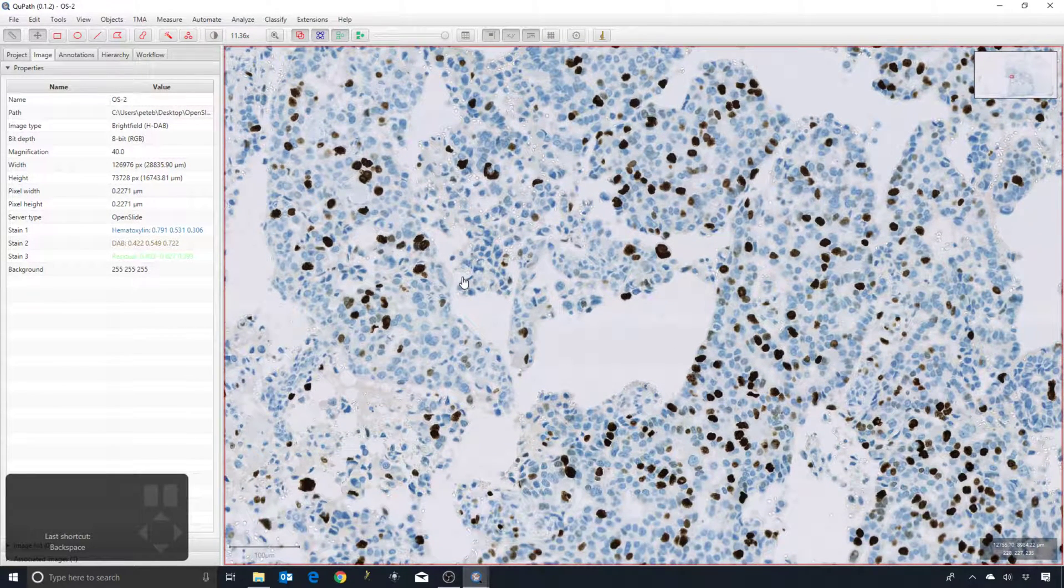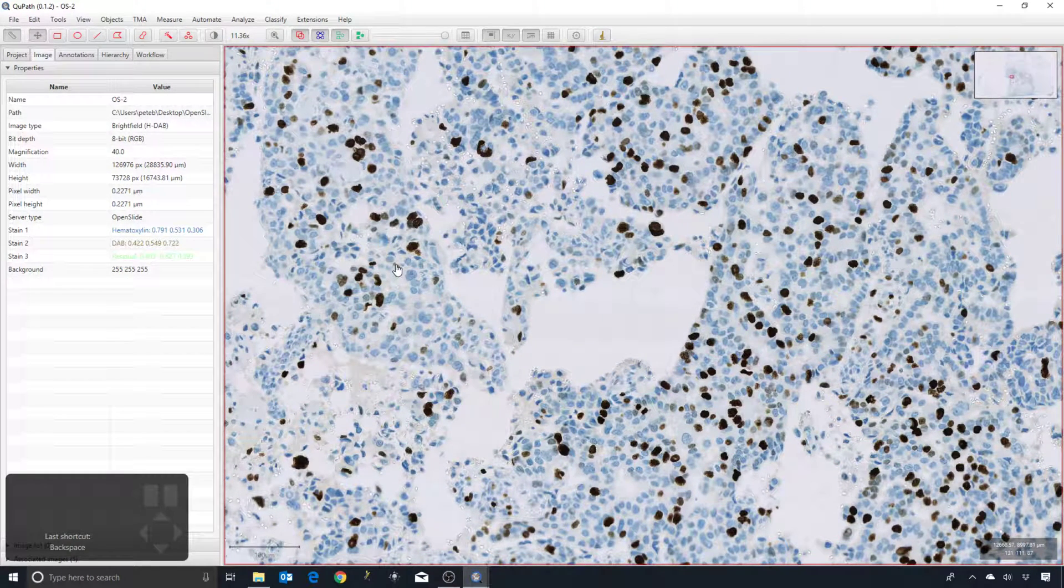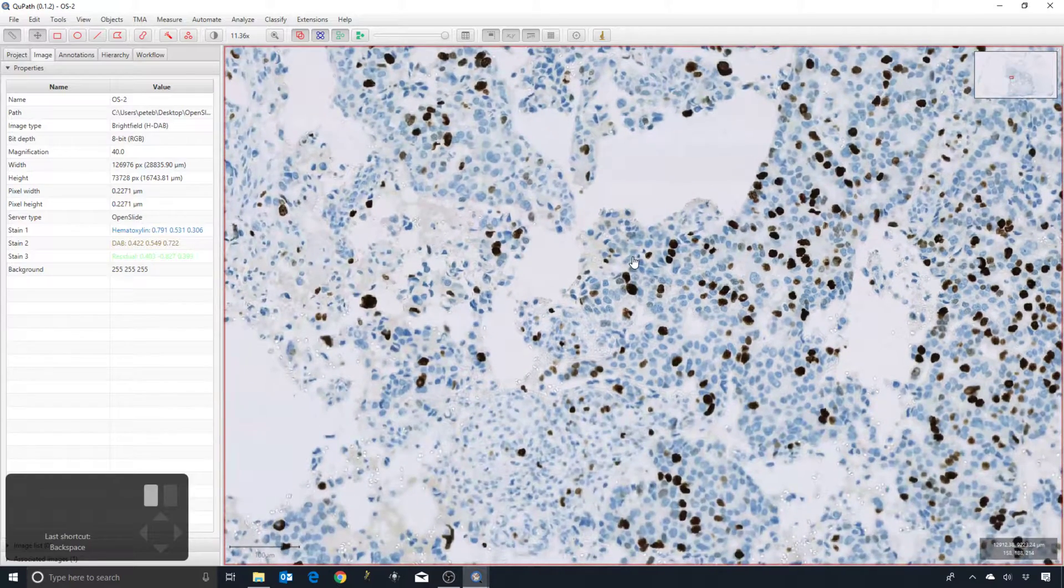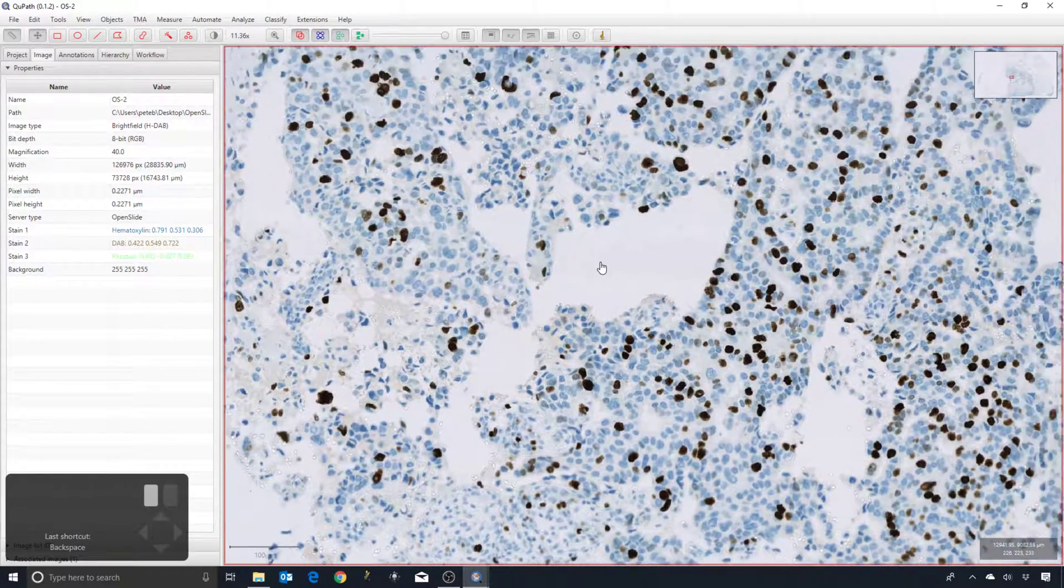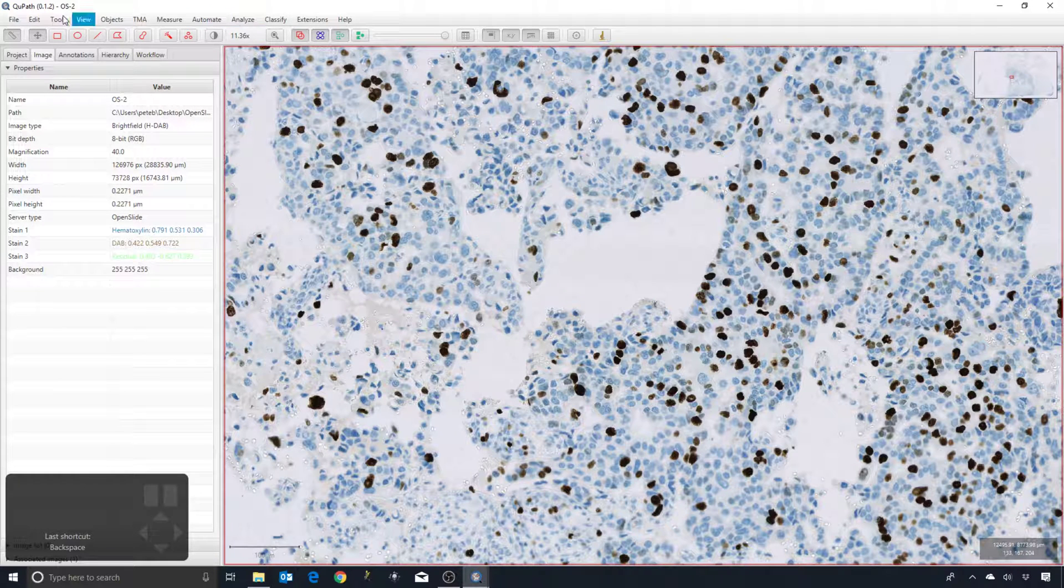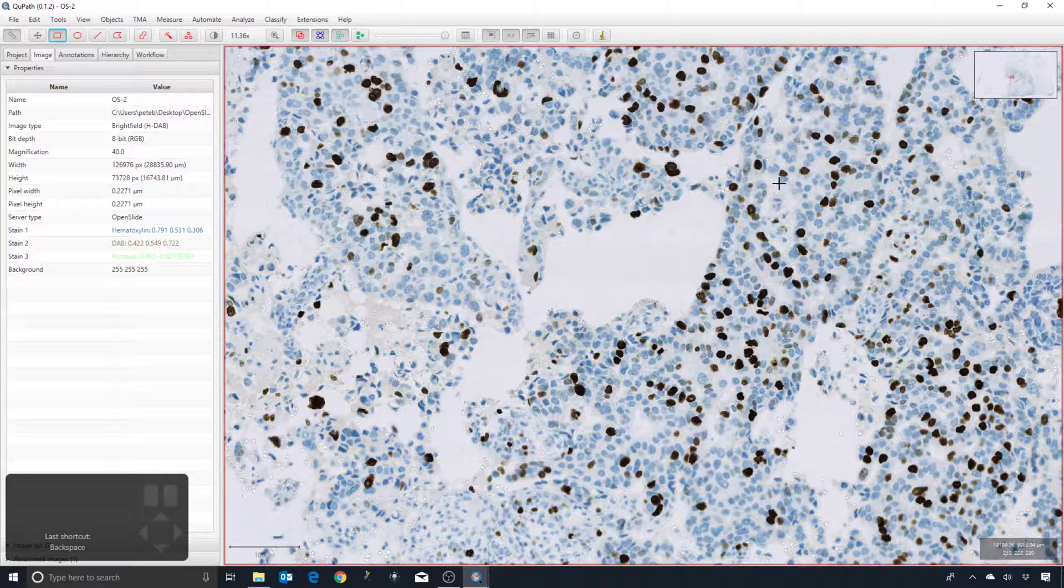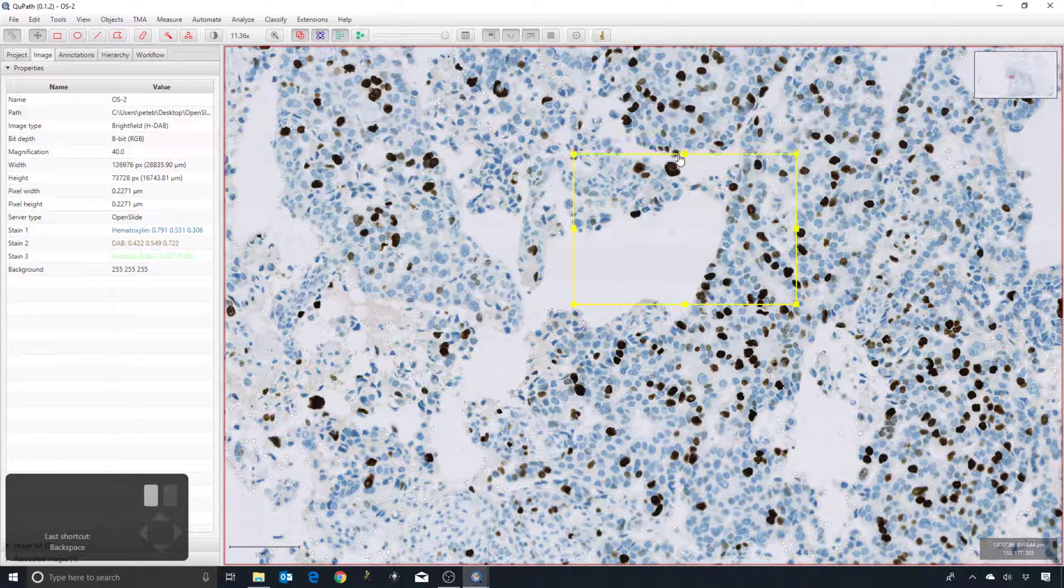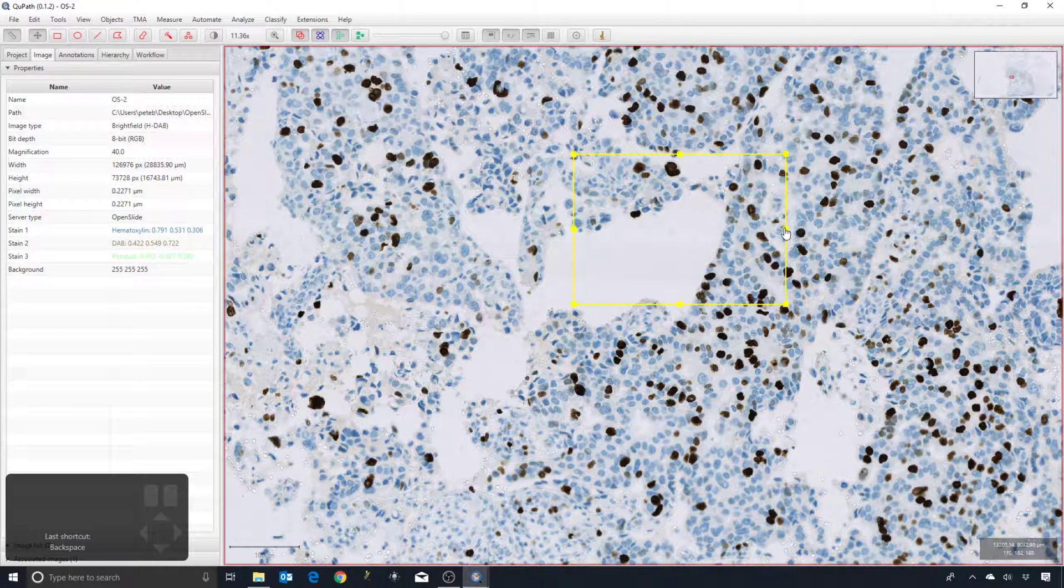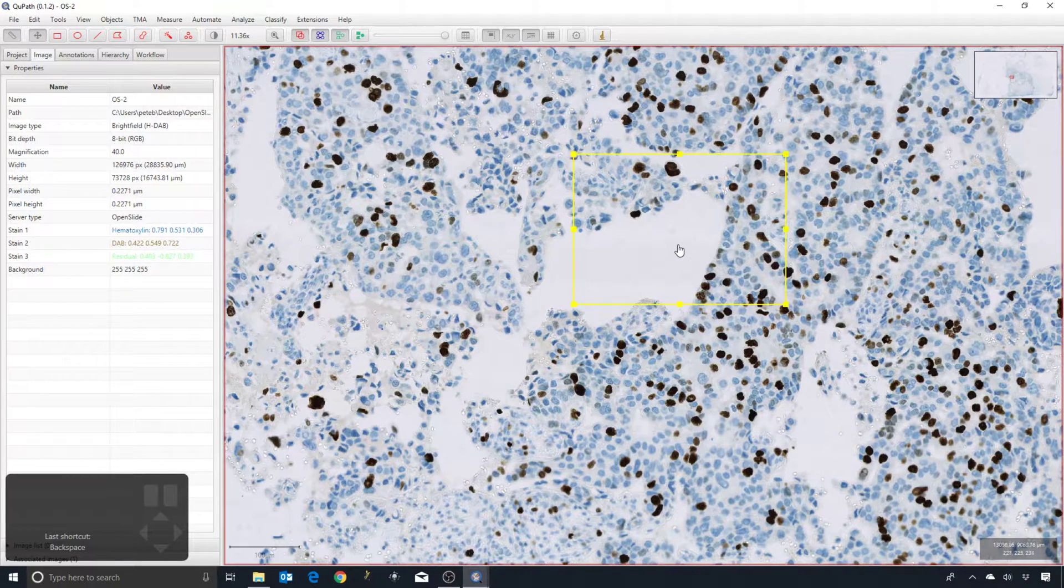Another way in which we can improve the stain estimate is we can give it a region from which QuPath then tries to set suitable values from within that region. To do that, I want to select an area that contains a reasonable example of very blue pixels, very brown pixels, and also some background.